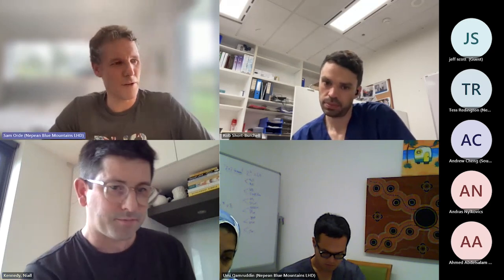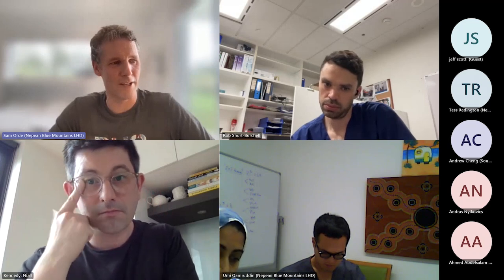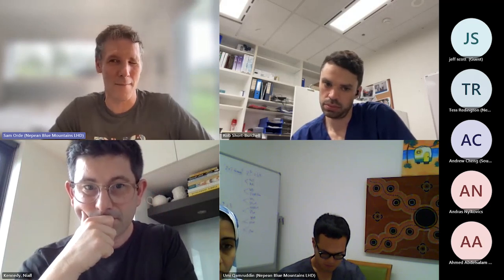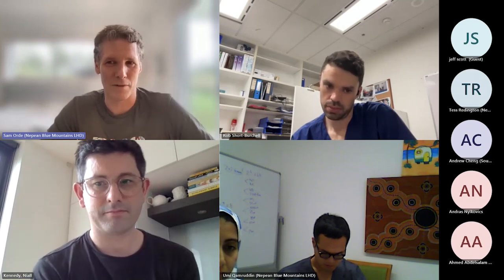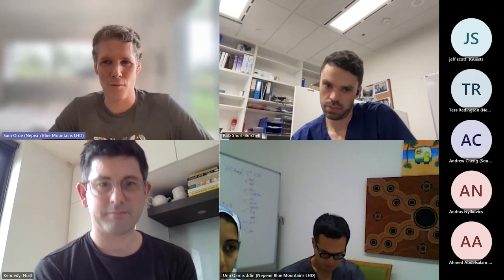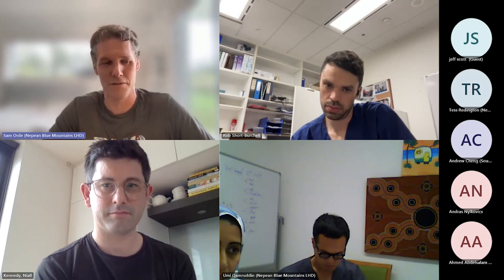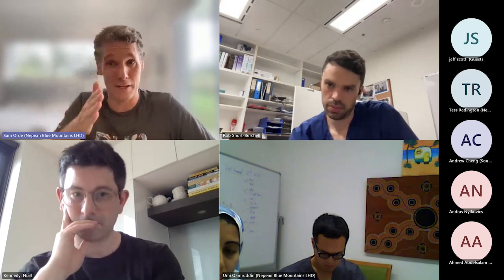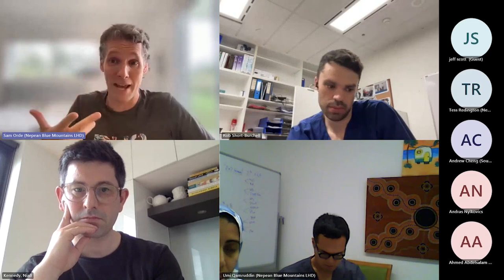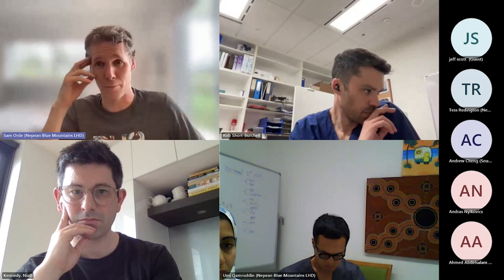Yeah, that's exactly right. I generally find that the diastolic dysfunction is not often different to how I imagined it clinically. If you think of patients as fluid overloaded, it's not really that surprising when you find an E to E prime that's bigger than 14, or a big E to A ratio, or reduced E prime values. In my clinical practice, I use the E prime, particularly the medial one, if there's no mitral annular calcification. If that medial E prime is less than 8, there's impaired LV relaxation, and therefore they are at risk of raised left atrial pressure.